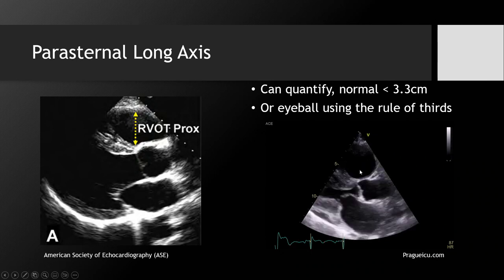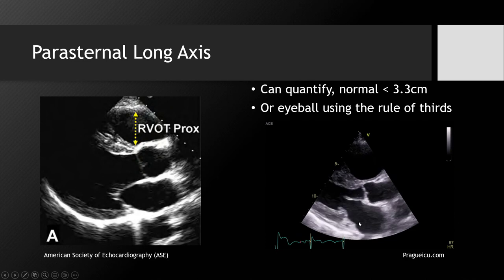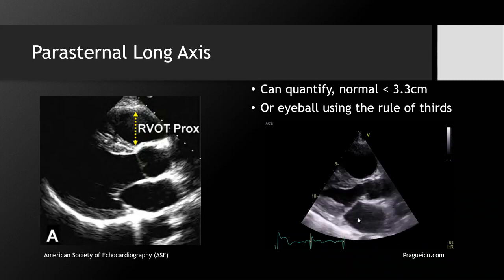This is a good moment to say, and I'll point this out later in the apical four-chamber, that you should not use the rule of thirds to assess whether or not you're on axis, right? Because you will not be able to use that in cases of pathology. So whenever you're thinking about things that will show whether you're on or off axis, you need things that are going to be true whether you're normal or healthy or whether you're looking at a diseased heart.